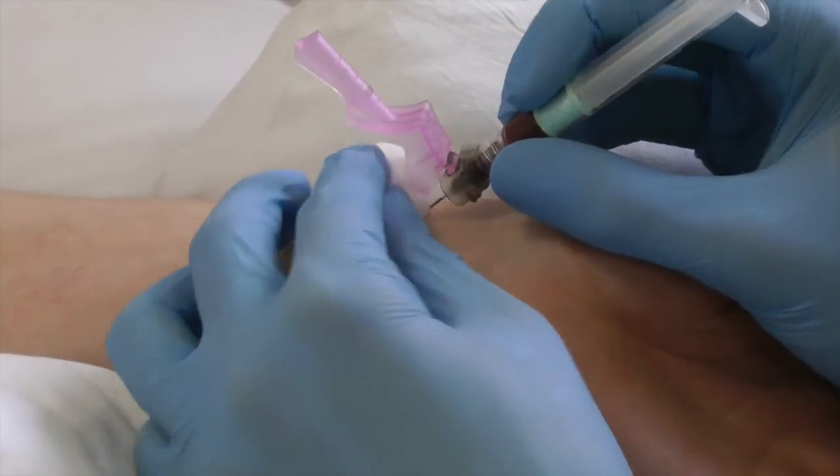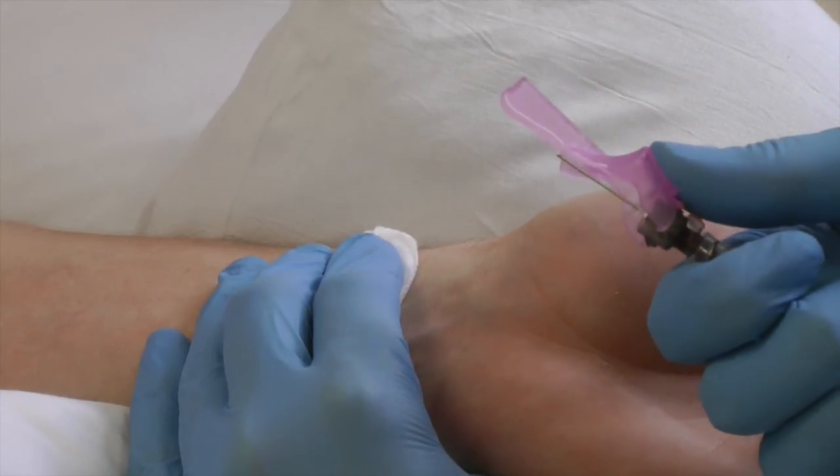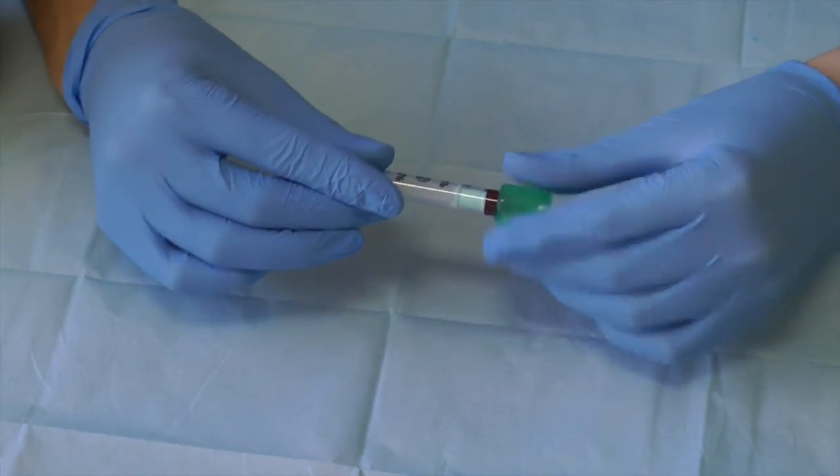Remove needle and apply direct pressure. Apply the safety cap. Process sample.